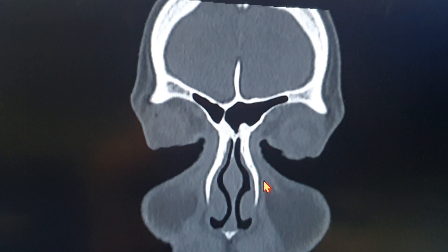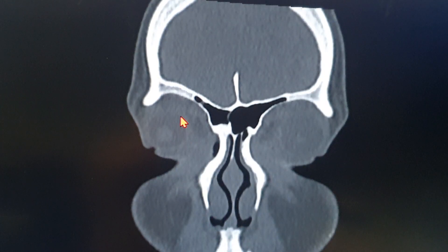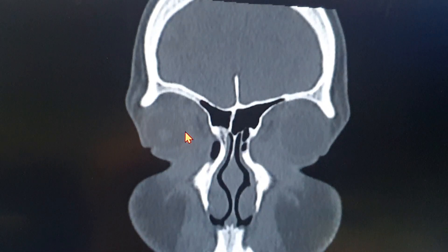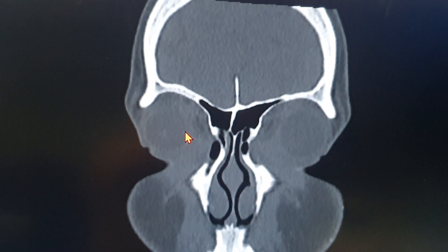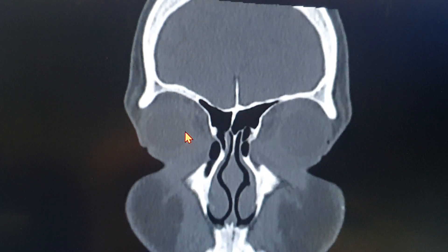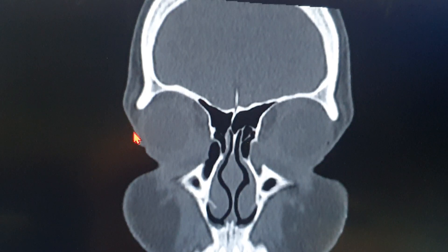That's the frontal process of maxilla, that's the nasal septum, those are the bilateral inferior turbinates, and you can see the orbit starting here. At this point you cannot appreciate any swelling or soft tissue shadow on the CT scan in the extraorbital compartment, because initially the patient had a lot of swelling but the medications reduced it — hence the reason there's no visible shadow here.